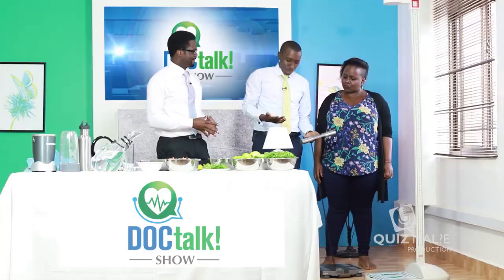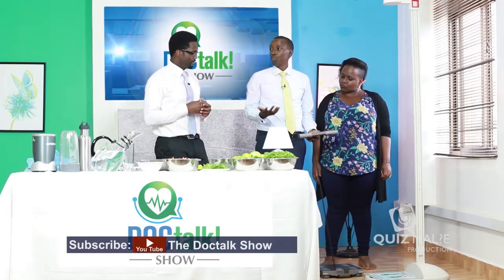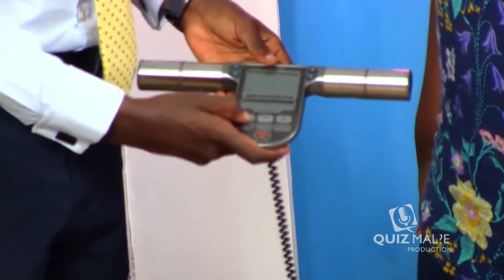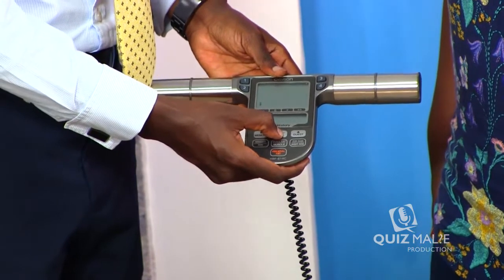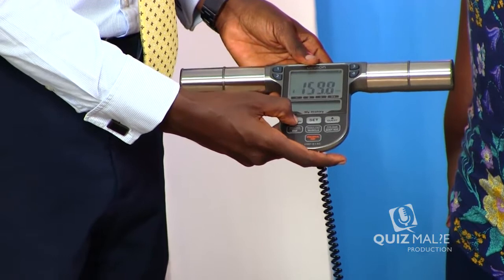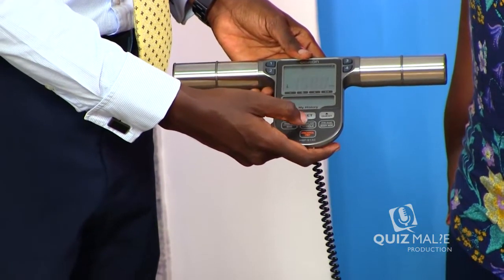No, it's an advanced body composition scale, and it can also measure three other things. It can measure the fat around your belly. Okay. It can measure your metabolic rate, and it can also measure something called your body age. So this scale requires that you input your height and your age, and so we're actually doing that right now. We're also setting her sex, her gender. So this is female, there's male and female, so we are setting for female, and then we're going to set her height, which we measured as 1.58. All right. Okay, and then we are all set.